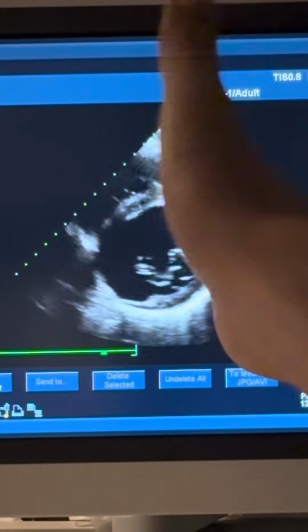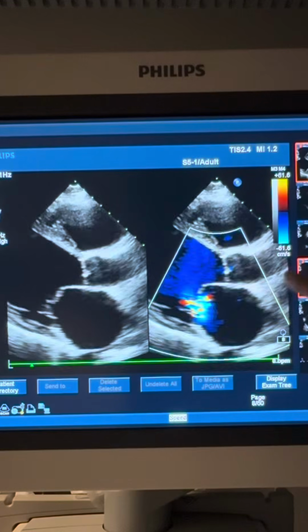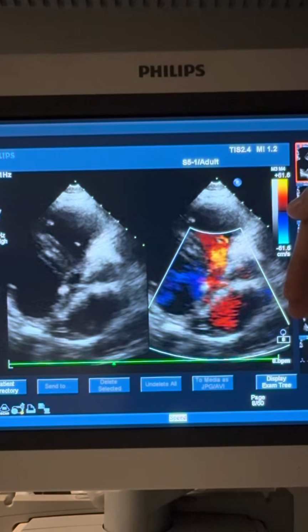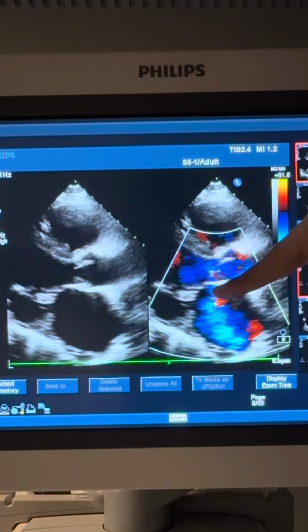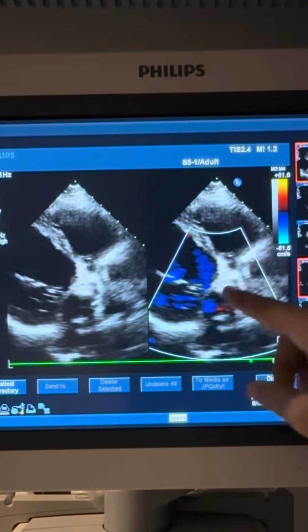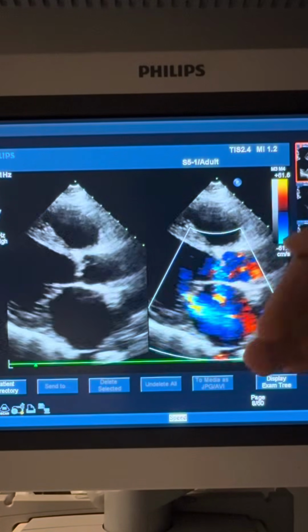So this is called long axis sweep. Let's do this. Good. I started here by the standard parasternal long axis view, and then I'm tilting now into the tricuspid valve, and then coming back from the tricuspid, the first scallops will be A3 and P3, and then more to the left, standard parasternal long axis, and then A1 and P1, and then after that, the pulmonic valve. See, this is called long axis sweep.